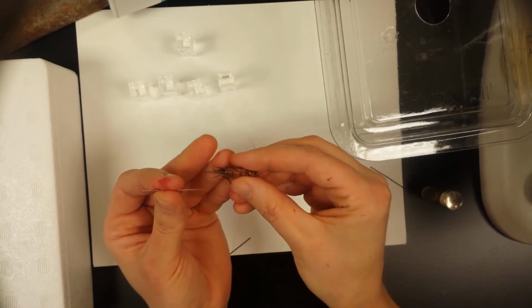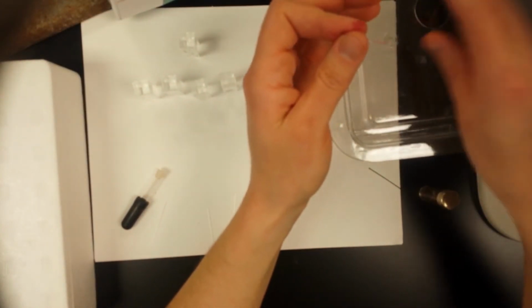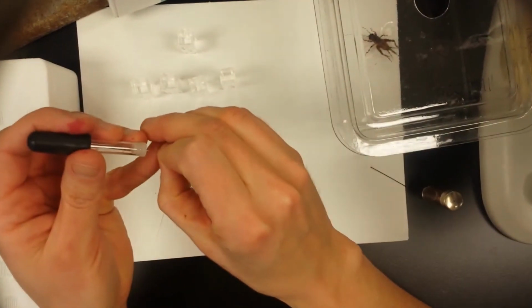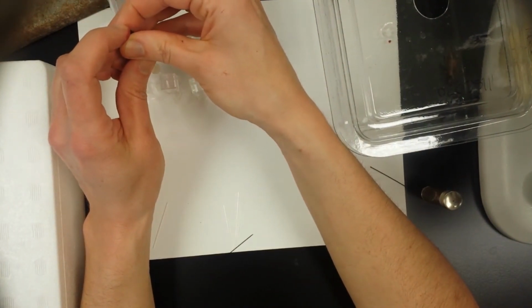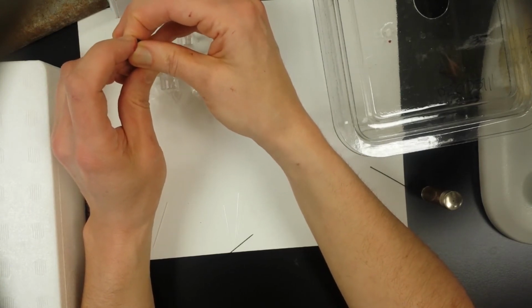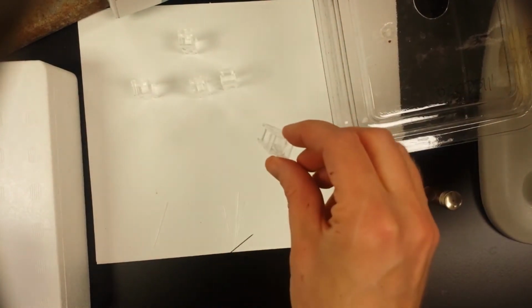Some crickets are juicier than others, so we'll call that good enough. Okay, and then I'm going to put this tip on here, cover the end, and then I'm going to squeeze it into one of these cuvettes to release that sample. Okay. Now we can measure the absorbance of that sample in a spec.